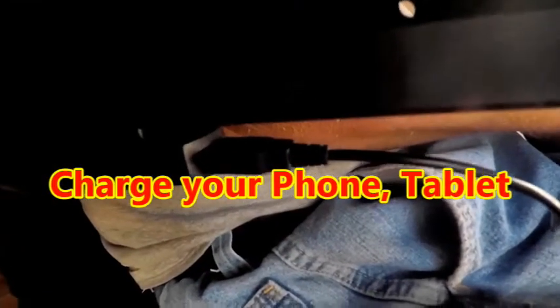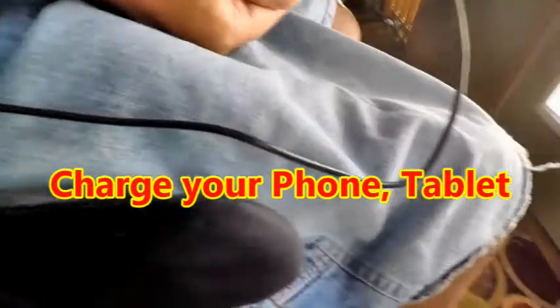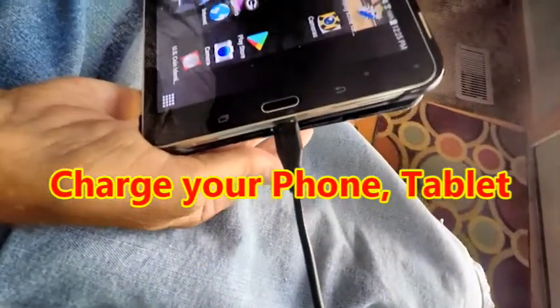Power chair advancements are charging ahead, probably faster than some of us will appreciate. Things like Bluetooth wireless to control a computer mouse, or a USB to charge your phone, and you can even answer your phone through a joystick of the more modern power chairs. If nothing else, I hope the content of this video helps you become more familiar with some power chair terms that might help with your power chair selection.